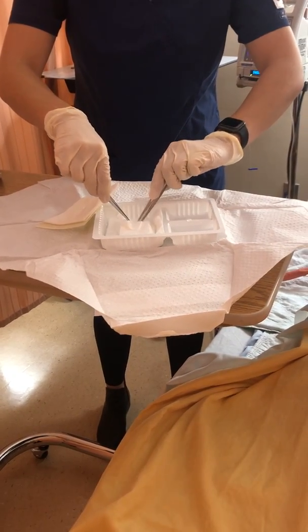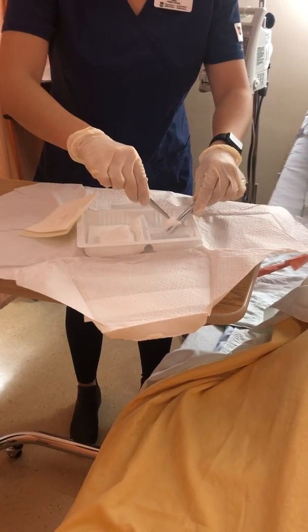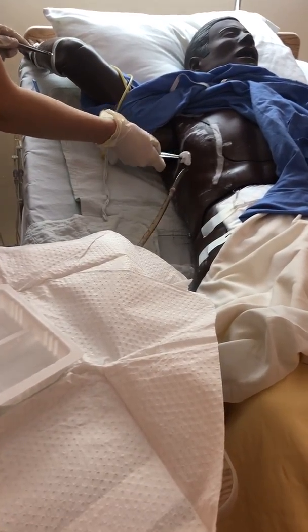So I'm going to do some rosettes here, a little bit of normal saline, drain it out, 1 swipe per wipe. So I'm going to start at the site here, around, discard that.